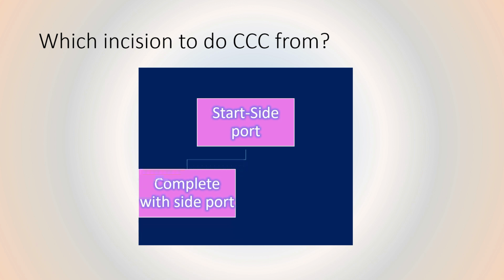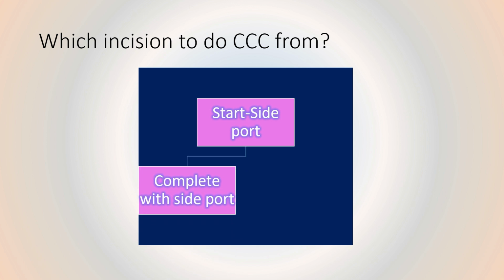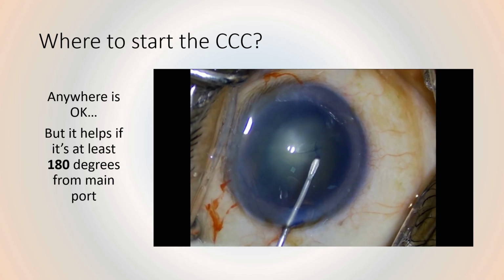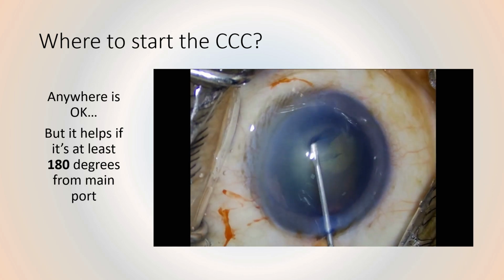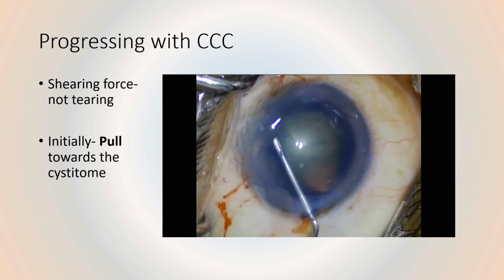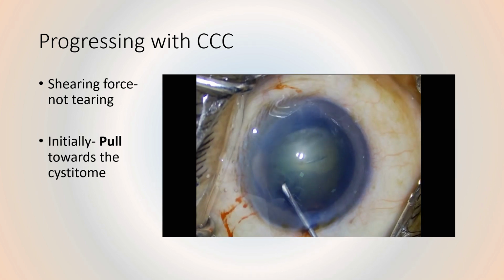What incision do we do the CCC from? Always start from the side port. You can complete it with the side port, or we can shift to the main port to finish it. Where to start the rhexis? Anywhere is okay, but 180 degrees from the main port would be good. How do we progress? With shearing forces.